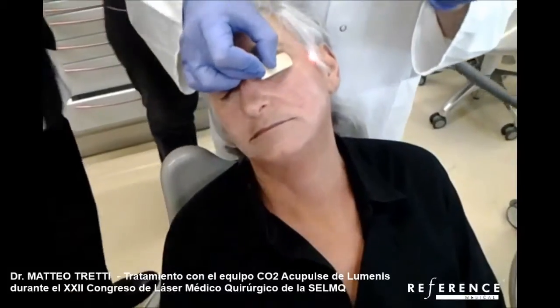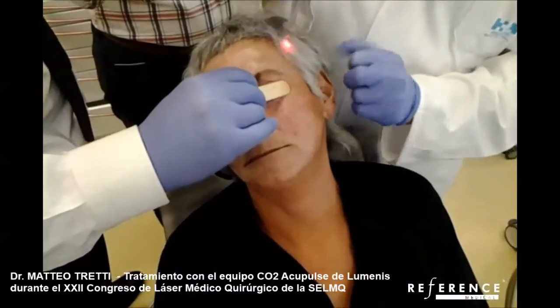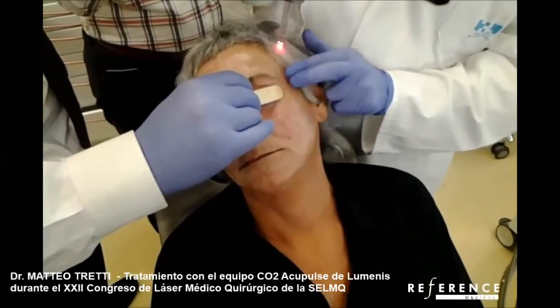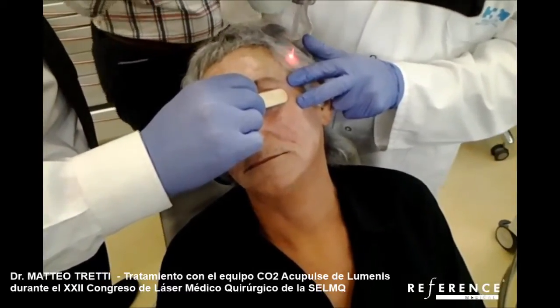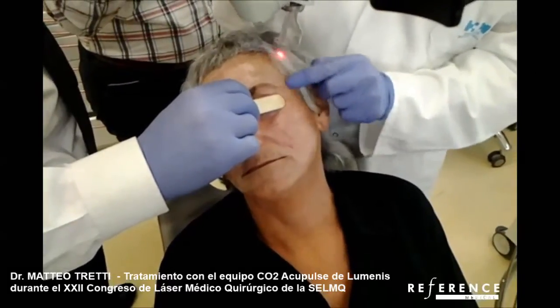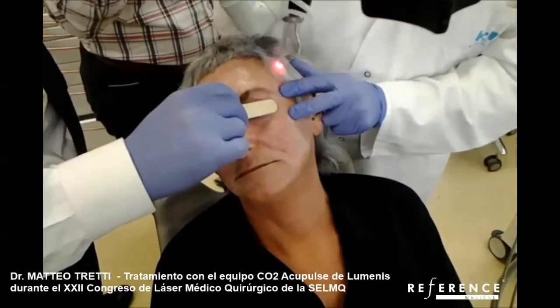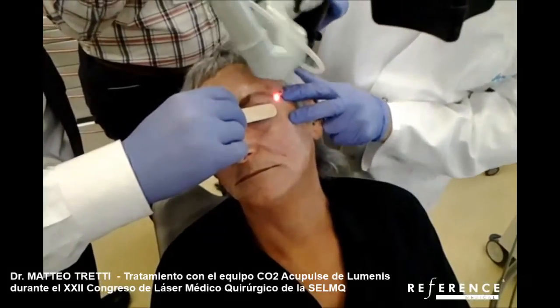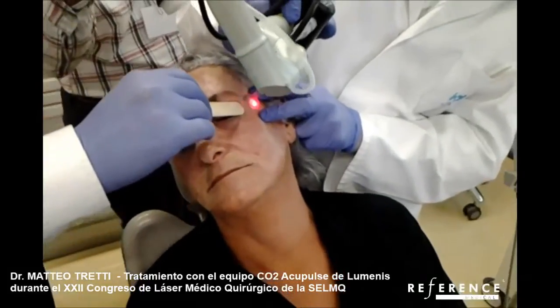Putting the tip of the tongue depressor exactly where there is bone, I clean the skin and enlarge it. Look at my finger — I enlarge the skin and stretch it backward. You can appreciate the wrinkles better. This is a practical, easy tip to apply to have better results over there.